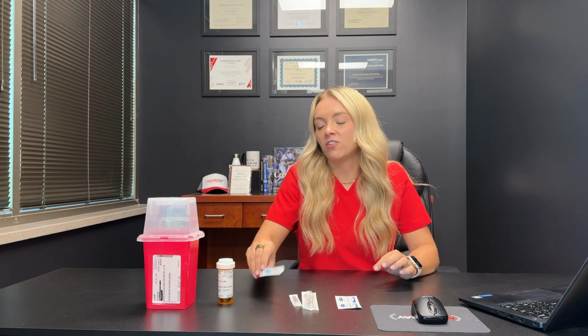To prepare for your injection, wash your hands with soap and warm water. Next, you'll need to gather all of your supplies for a singular injection. For one injection, you're going to need 2 alcohol preps, a syringe, a pink needle, a blue needle, your testosterone, and your sharps container.